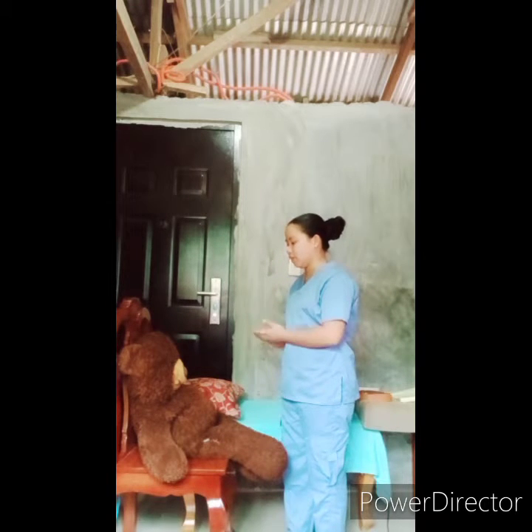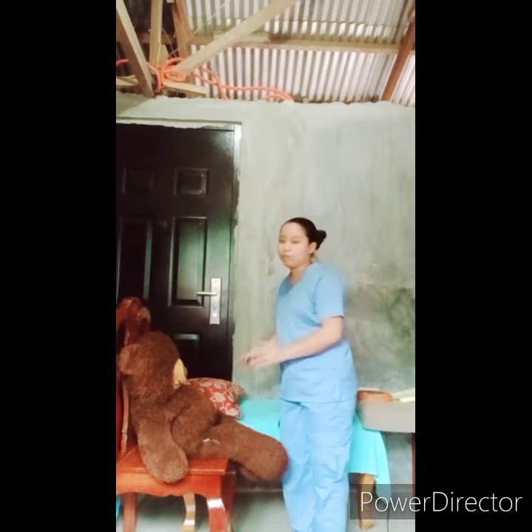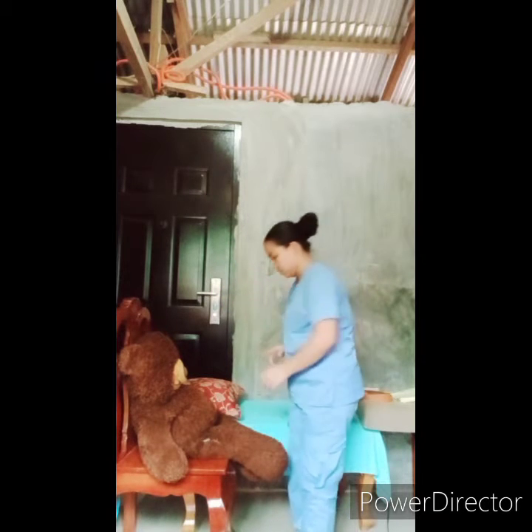Ma'am, I am going to transfer you using pivot technique and board technique. Next, let's transfer the patient from wheelchair to the bed if the patient is cooperative and weight-bearing. Using pivot technique, first, let's adjust the height of the bed. It should be level to the seat of the wheelchair. Next, let's position the wheelchair properly next to the bed, and let's remove the armrest nearest to the bed.